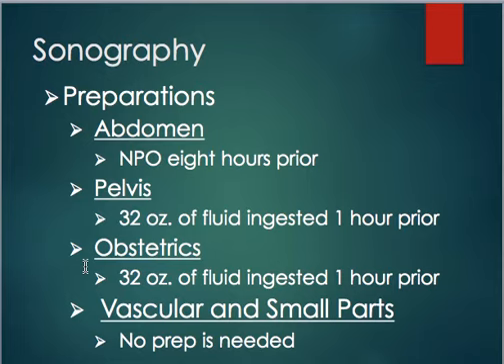If it's not full enough when they get there, you can scan them, see that, and then have them drink more. It is very hard. Be aware of your patient's comfort. I've had a lot of ultrasounds in my life, I have 3 pregnancies, and there are times where my bladder is so full, I am in excruciating pain waiting.